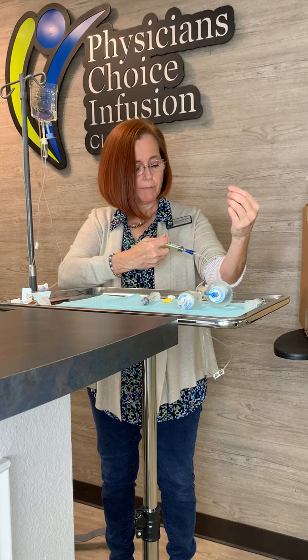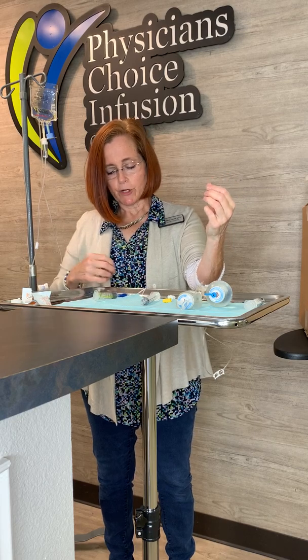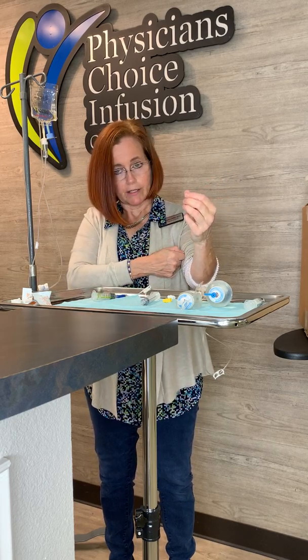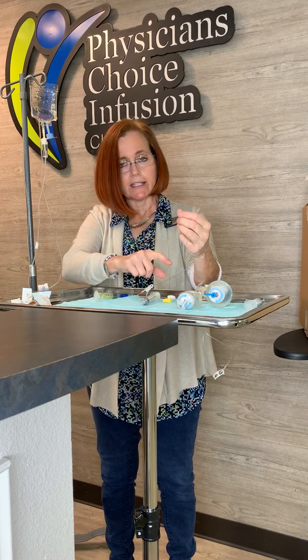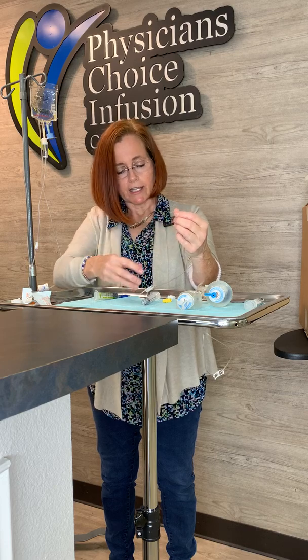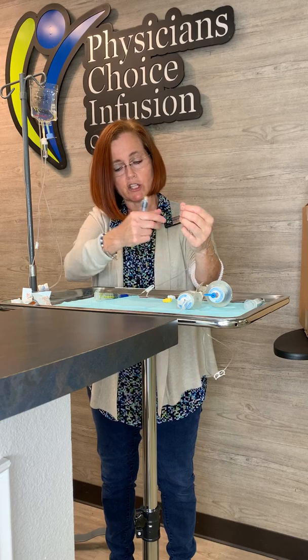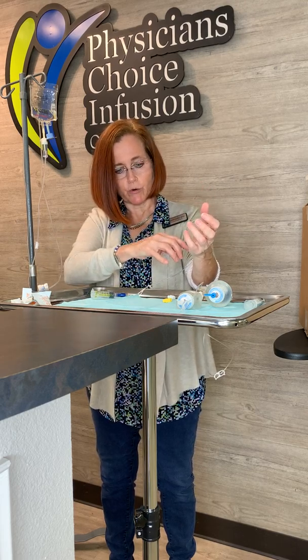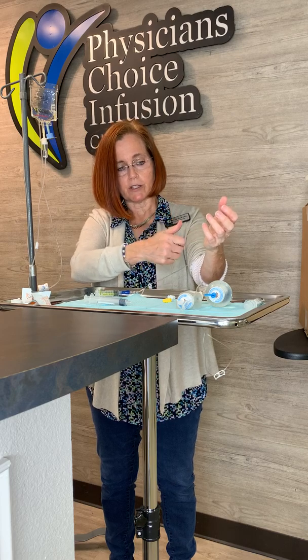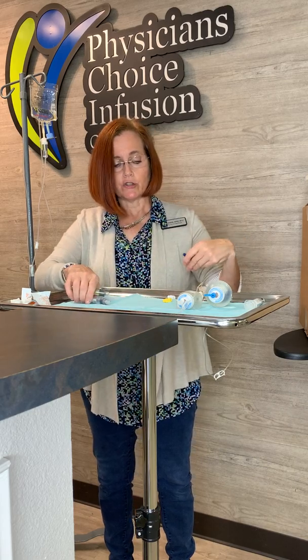Pump and release, pump and release with the heparin. If you have more than one port, leave your heparin on that port — just leave it there, clamp that port shut using the clamp at the top. Then take care of your second port, because sometimes you can get confused about which port you just flushed. This way you know you just finished this port and then you can flush the other port. When you're done flushing the other port and your heparin is on it, take your heparin off, close your clamp, and you're done.